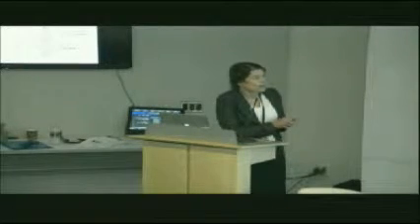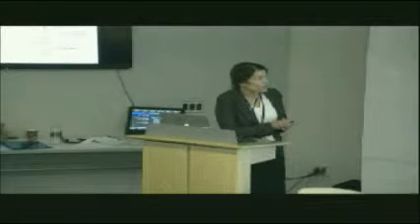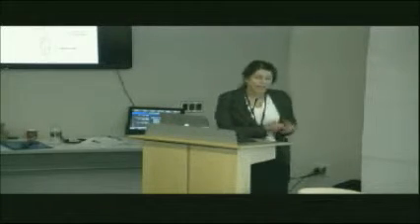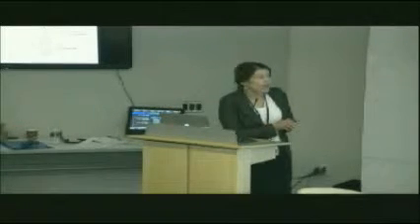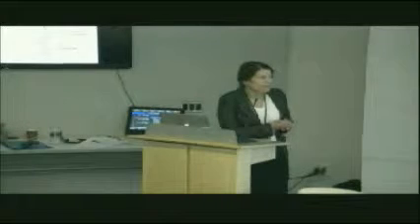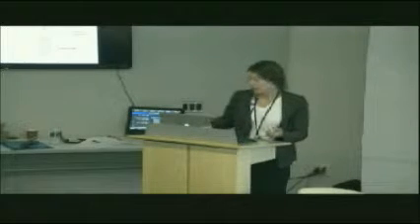Now, this was similar to peripheral nerve studies. The amount of time it takes to get from stimulating here to down out here to the muscle is important. So you can stimulate up here, or where the motor cortex is. You can stimulate down lower in the brainstem, and you can even stimulate at the top part of the spinal cord. And that's important because it gives us an idea of how long that signal took to get from wherever we stimulated out to the muscle. That tells us something about how healthy the tissue is, how healthy that pathway is.